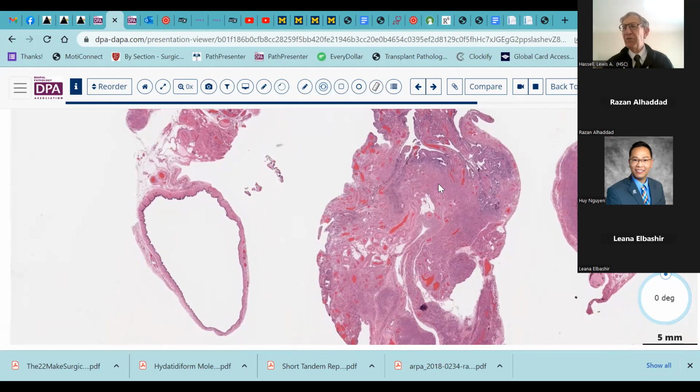But if you wanted to become hyper about it, you might be able to detect differential expression of things like androgen receptor, or other hormone markers, WT1, and other sorts of things of that nature that might give you some differential clues as to whether something was the same as the fallopian tube or different from that tube.